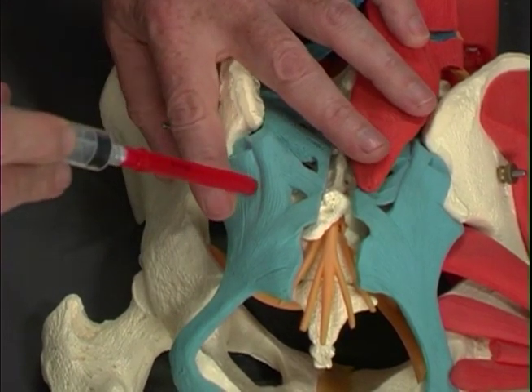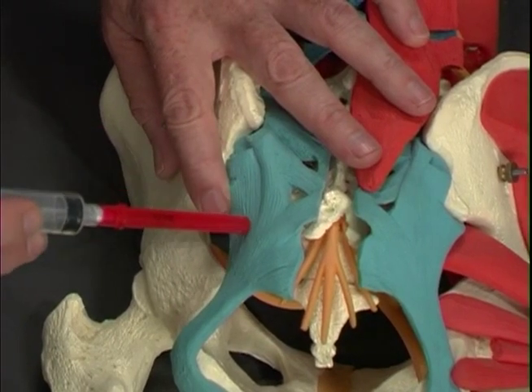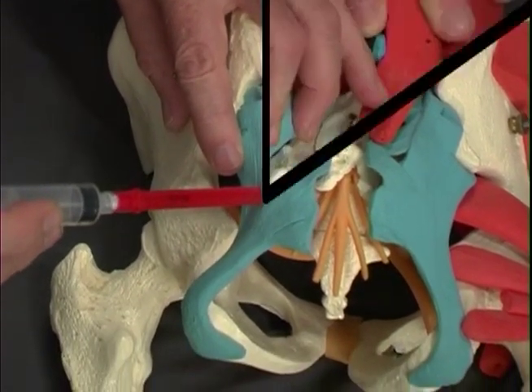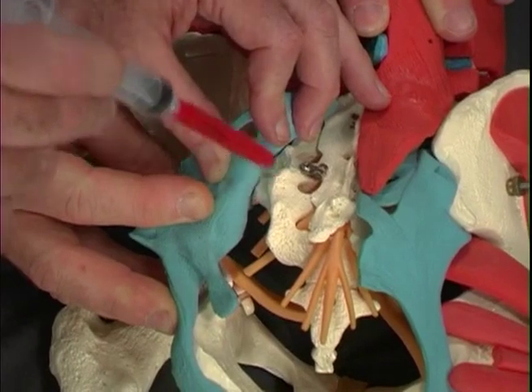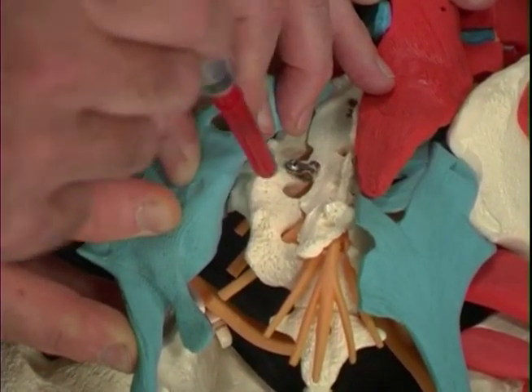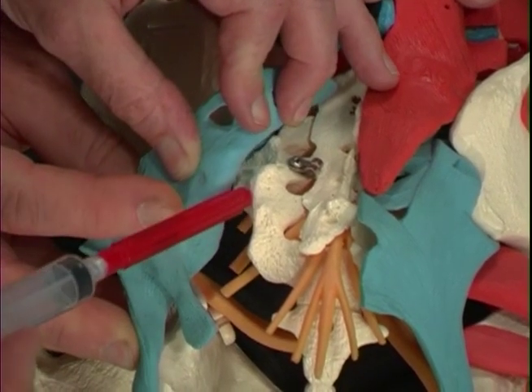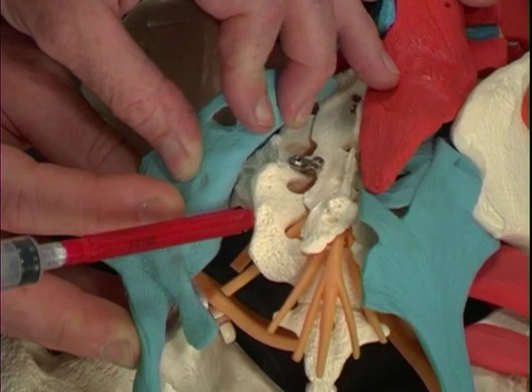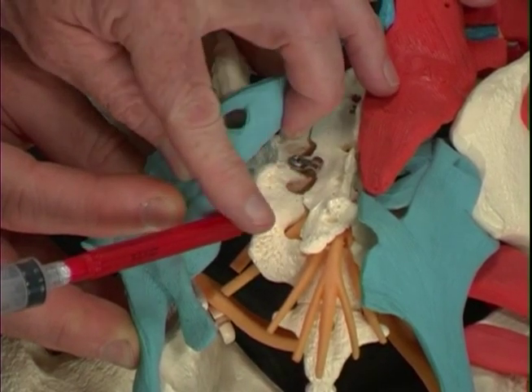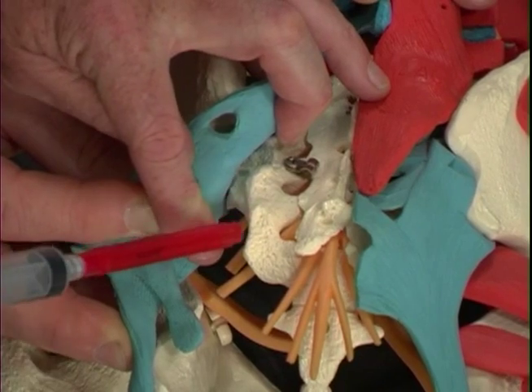Then, once we found the edge, drop down so that we're catching the fibers along the lateral border of the sacrum. Again, to demonstrate that, we come down until we hit the edge of the sacrum with our needle, and then we come in laterally and hit the lateral border of the sacrum from this direction. This requires a lot of tissue being pushed down out of the way so that the needle can get in and reach that lateral border.